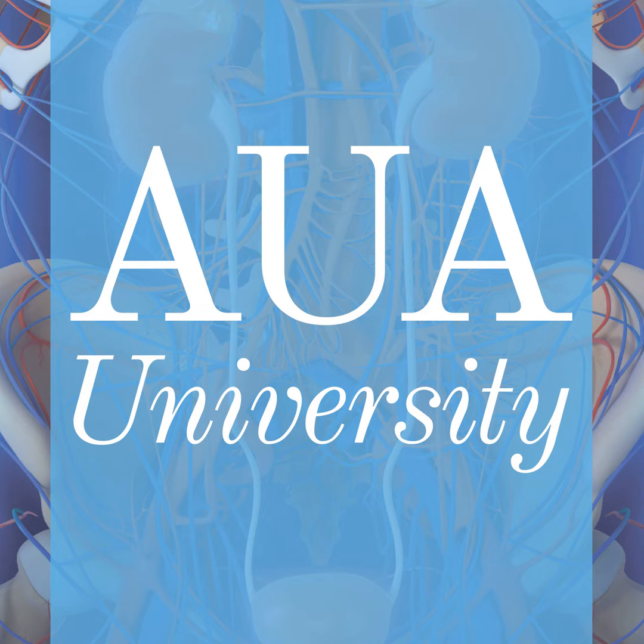This is a typical image of those patients, a typical multiparametric MRI demonstrating a small focus or even a large focus of radiorecurrent disease. When we did a PSMA PET scan in the same patient, we could delineate the same intraprostatic localization of the tumor. We also identified the infiltration of the seminal vesicle, so those patients usually get a biopsy of the seminal vesicle and then they undergo surgery, which showed locally organ-confined disease, negative lymph nodes, and a negative surgical margin.